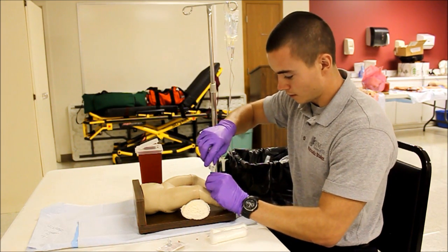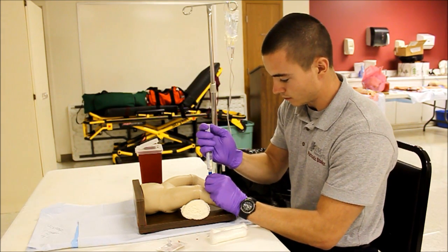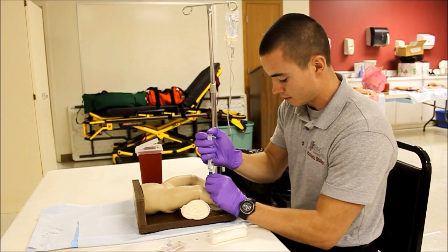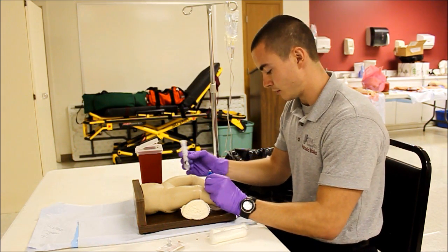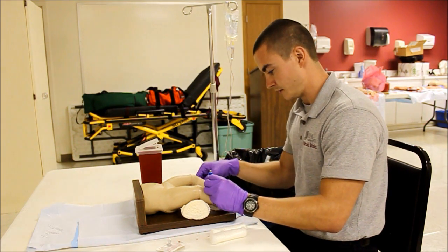I'm going to go ahead and try to aspirate some bone marrow — draw back on the syringe. Once I see that I've aspirated some bone marrow, I'm going to go ahead and flush the site. After I flush it, I'm going to make sure there's no infiltration, as well as no redness or edema.